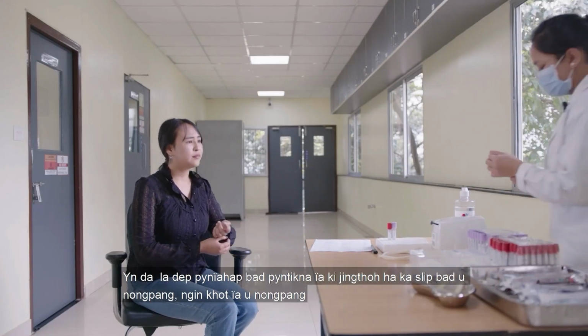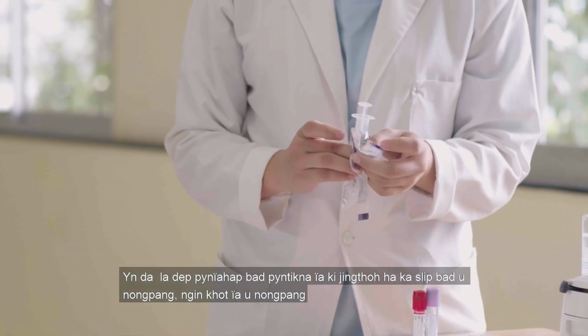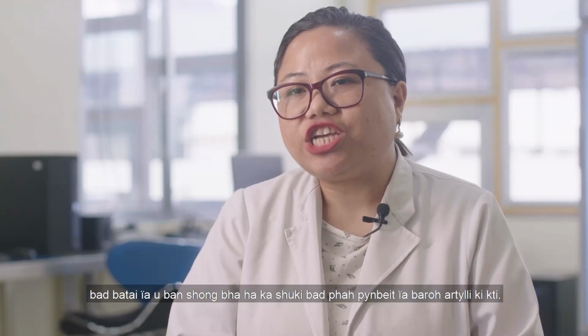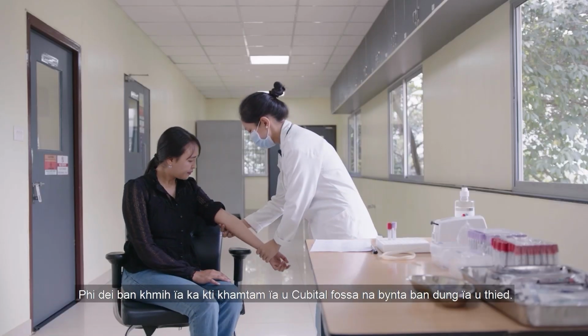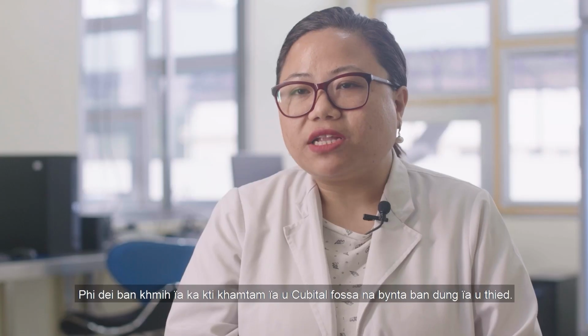Once we have correlated and confirmed the data of the test requisition form with the patient, we're going to call the patient and tell the patient to sit in the chair comfortably, and we're going to ask the patient to extend both of their arms. You're going to inspect the forearm, especially the cubital fossa, for venipuncture.